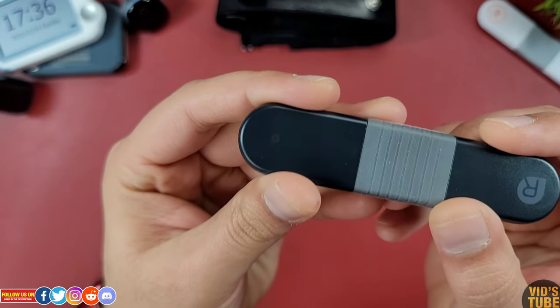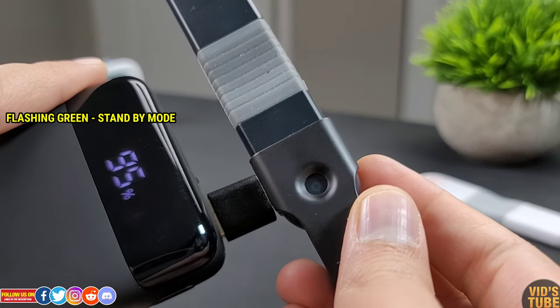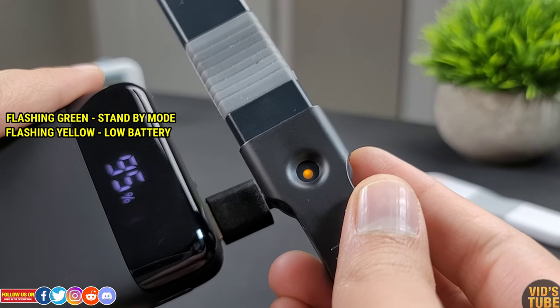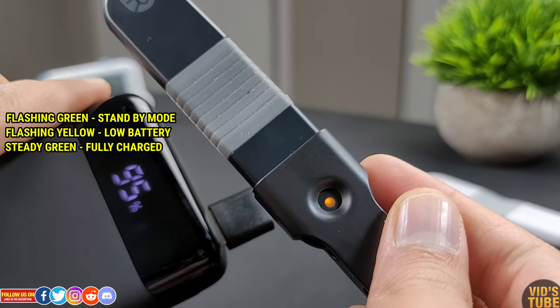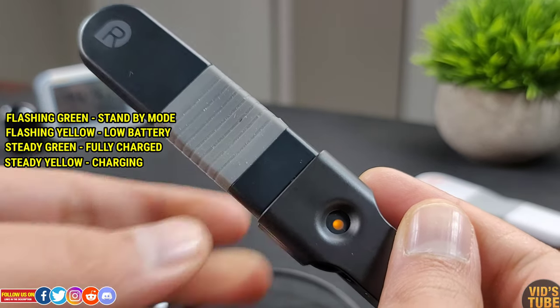On the left side, there is an LED indicator where the flashing green light means standby mode, flashing yellow means low battery, continuous green light means fully charged, and steady yellow light means charging. No light obviously means the battery is depleted.